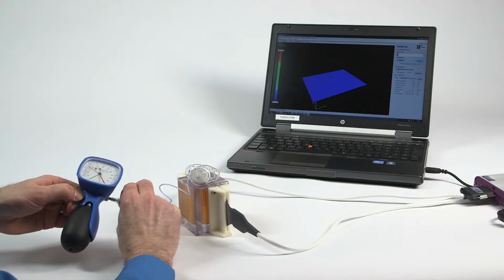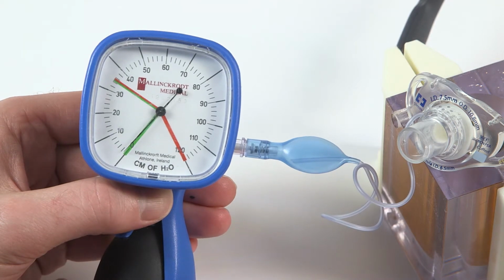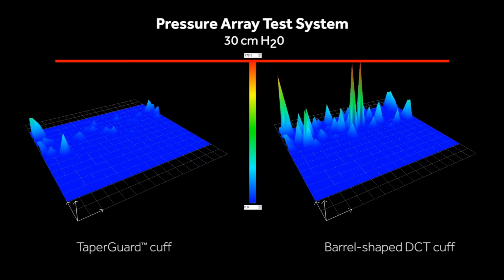Initially, we fully deflated the cuff so that it was under vacuum and as tight to the product shaft as possible. We then inserted the product into the model trachea. We alleviated the vacuum in the cuff and had an intracuff pressure of 0 centimeters of water. We then proceeded to inflate the cuff to 10 centimeters of water. We extracted the relevant data. We then increased the intracuff pressure to 20 centimeters of water and finally to 30 centimeters of water.